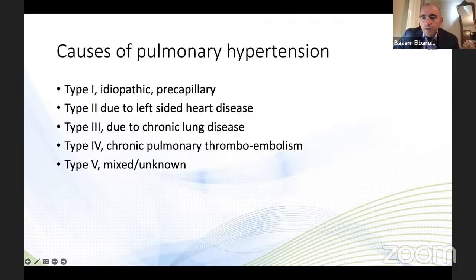Mahyar, I'm not sure if you do this or not. One of my colleagues does this, and he's pretty confident doing it. If you're not sure that you're wedged, you can inject contrast through the tip of the Swan, and you can see if there's any blood leaking back or if it's all going down to the pulmonary artery. That would give you a good clear sign that you're wedged. The problem with that is that you now have to flush the whole system again and clear it from contrast to get a good waveform. And if there's severe pulmonary hypertension, I probably would avoid doing that.